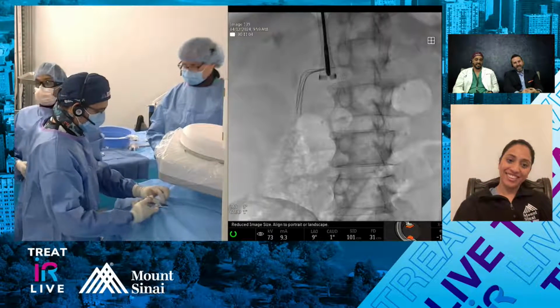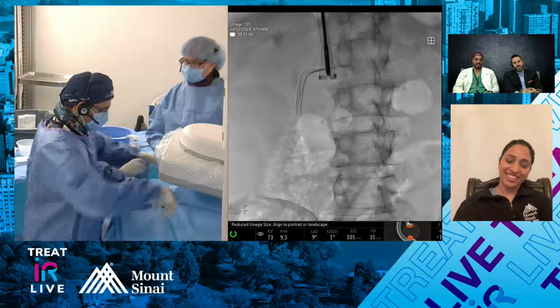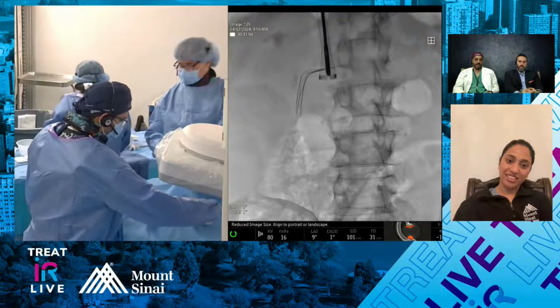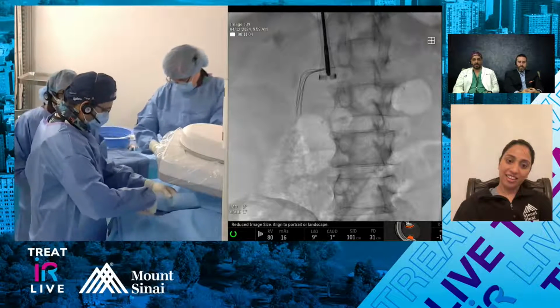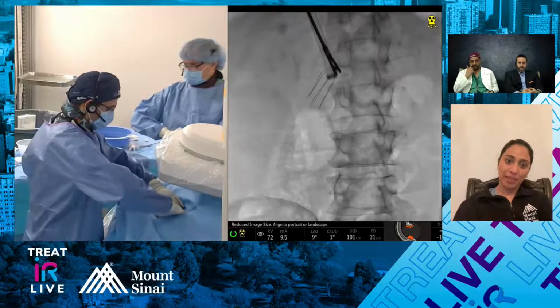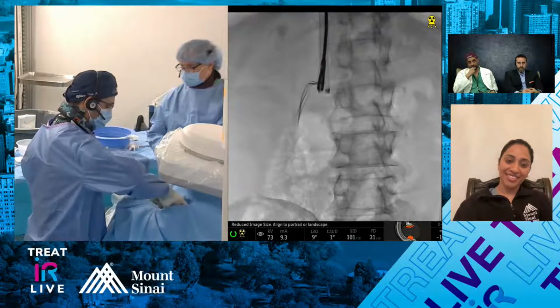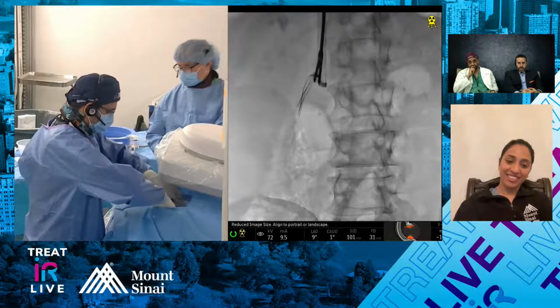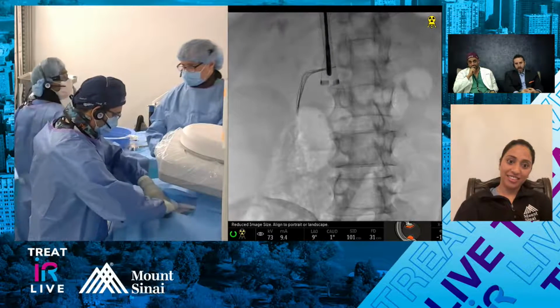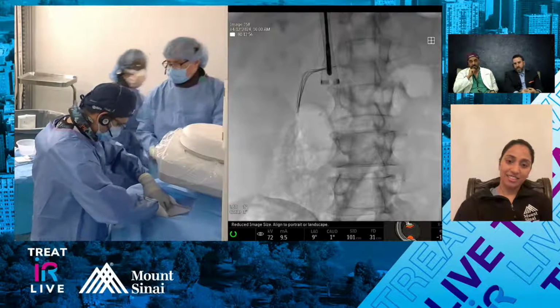I guess, does anybody think that with some of the other sheaths this may not have happened? I think if we had done Mona's trick with the Gore, it might not have torn the sheath, because the Gore is pretty tough to shear like this. The Cook sheath's pretty thin. I think that's what we were talking about before, where there are limited options. I think the Centrant is a lot stronger, but like you were saying, you just don't have the length.